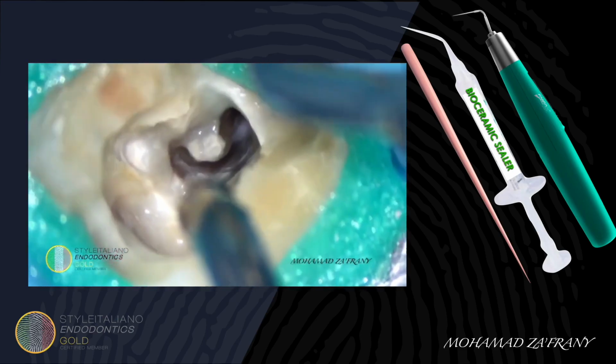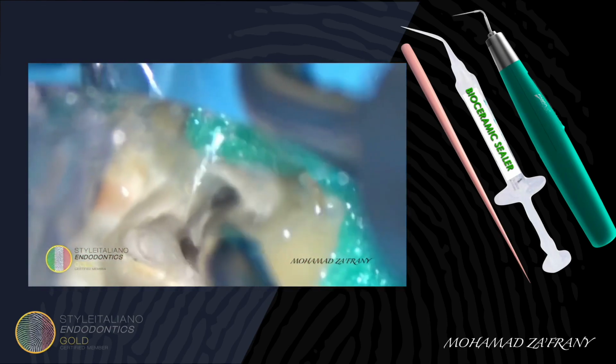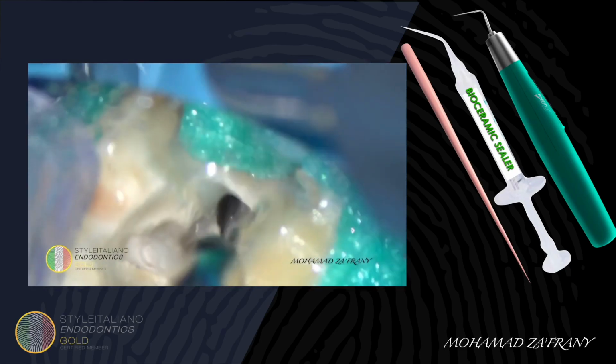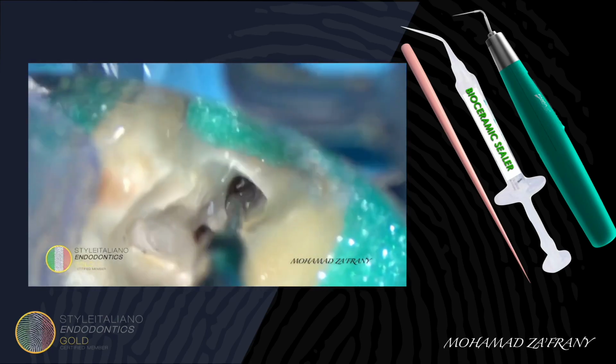Cleaning the isthmus using ultrasonics. This kind of case is very challenging in terms of cleaning and disinfection, and also in terms of obturation.